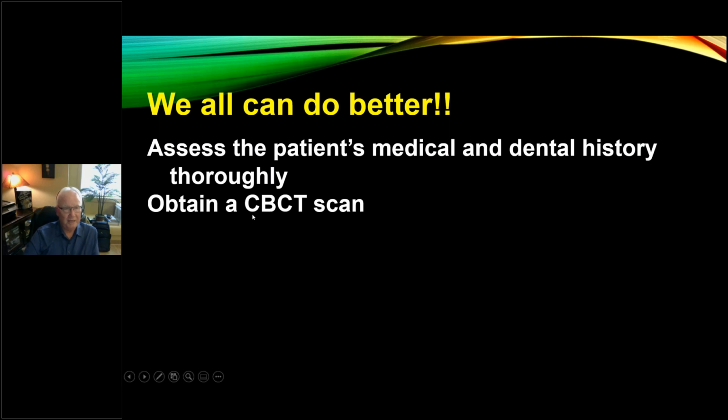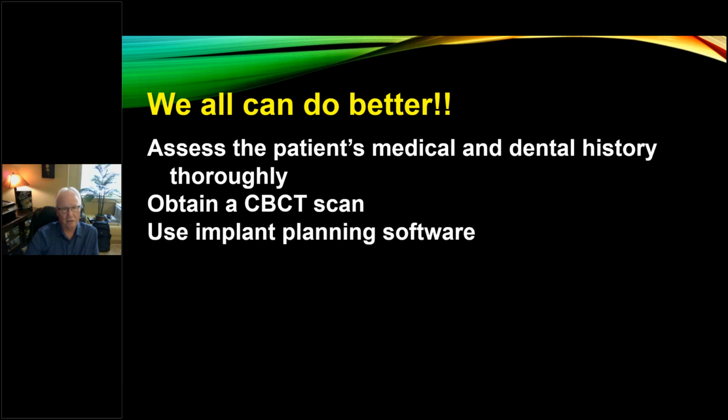When you do obtain a scan or the scan data, if you refer it out to somebody else to do the scan, you need to use that scan and the software within it for planning the case. I know, and I've had these discussions with Gordon. Oh yeah, we make a model and we, it's kind of like eyeballing again. I don't trust it. CBCT is an accepted technology.